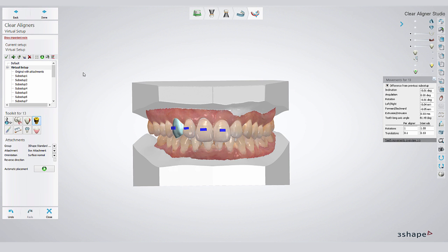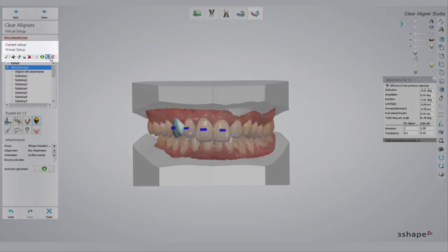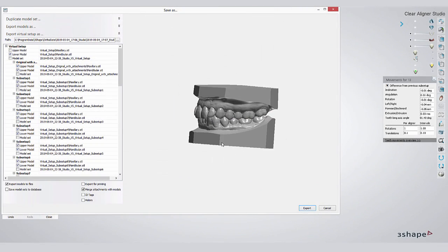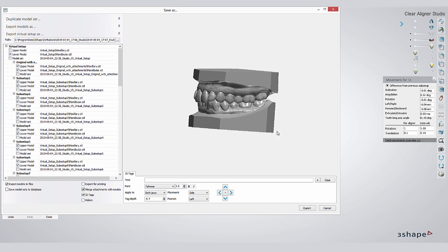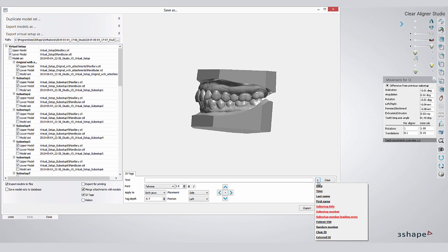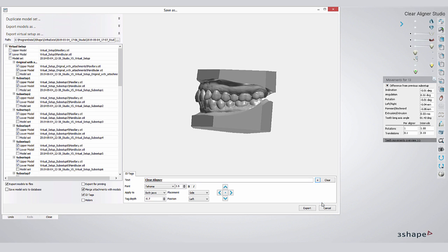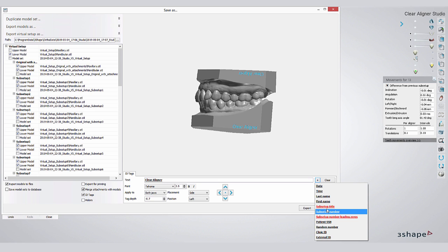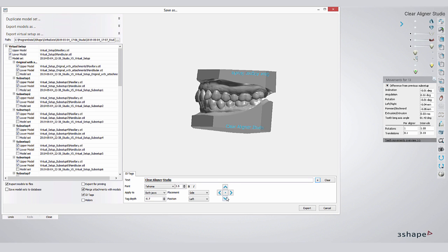Our last feature is the automated ID tag functionality. Once you've exported the setups for manufacturing, you can choose to add ID tags on each model stage. Select from a menu the information you want to print with the model, such as name, sub-setup count, and more. You can move each tag into its desired position.